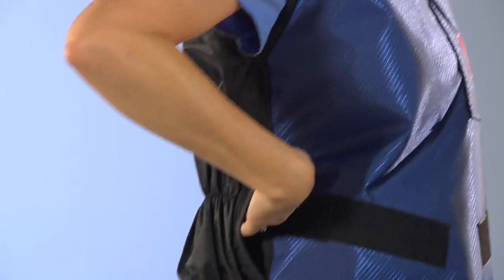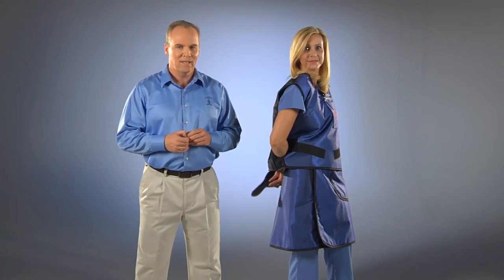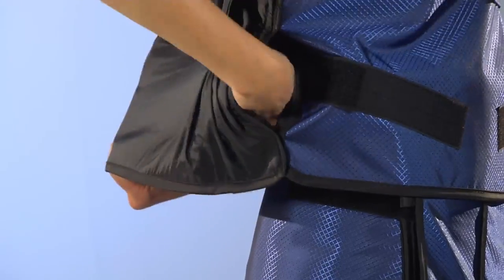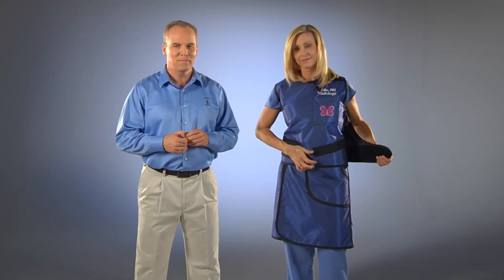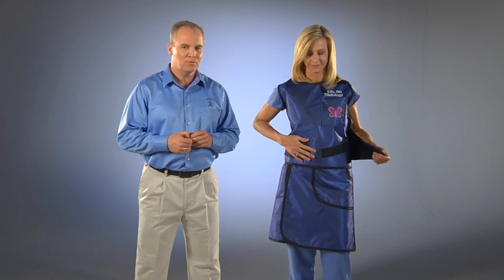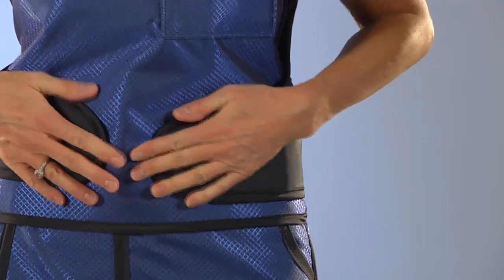Next, use your right hand to reach into the slot located on the right side and reach across your back to feed the velcro paw to the front of the apron and place it on the velcro patch on the right side. Then reach around your back to pull the left side velcro paw around front and place it on the velcro patch on your left side.